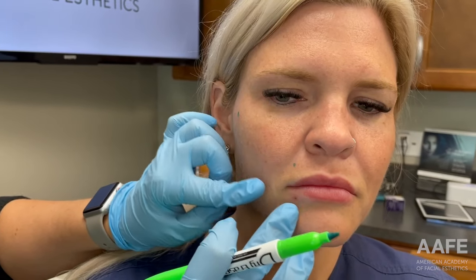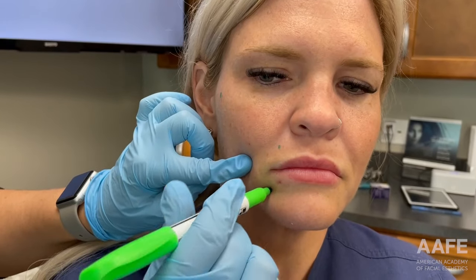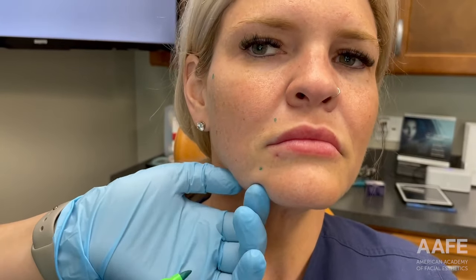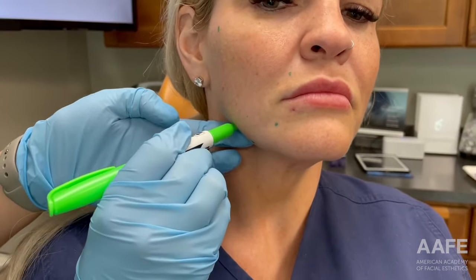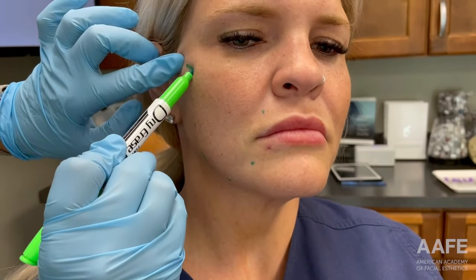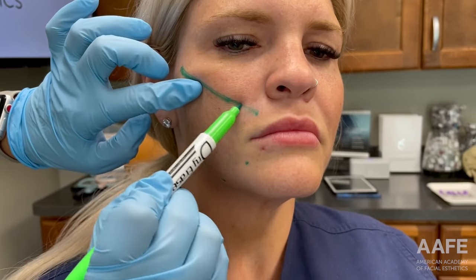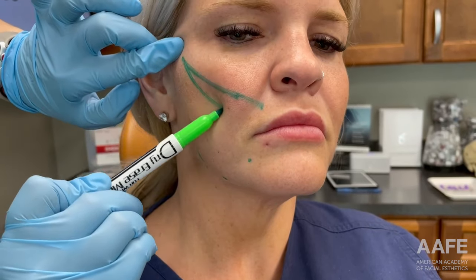The next area is the marionette line. You can see as I pinch and exaggerate that deficit, we're really going to try and lift this back to take some of the tension off of the tissue there. It's really important that you're properly trained. There are a lot of landmarks that we need to be mindful of here, and having that background is incredibly important to not only deliver the best results, but keep your patients safe and minimize the risk of complications as well.